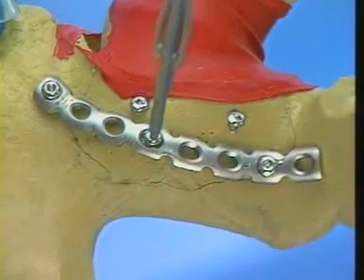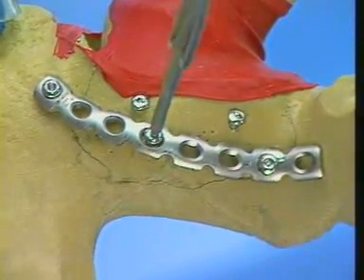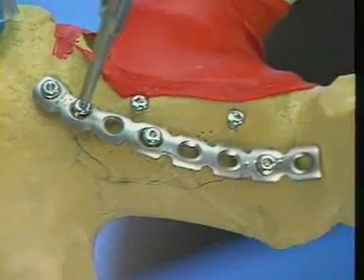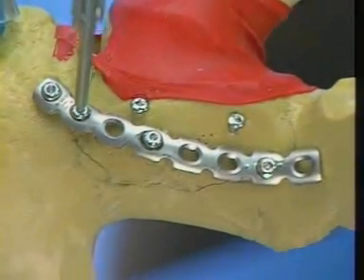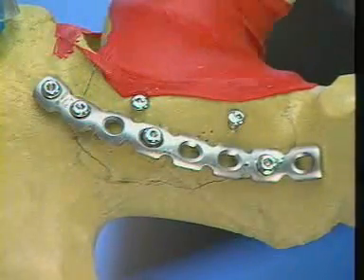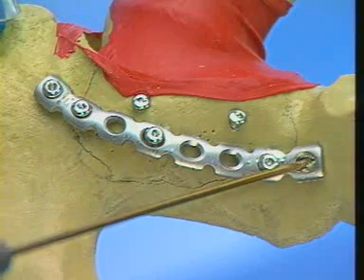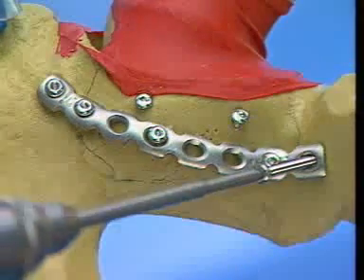Always take care to direct the screws away from the joint. Another screw at the upper end of the plate is inserted. A final screw is directed distally into the ischium.